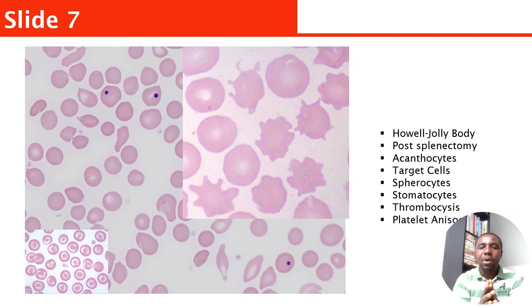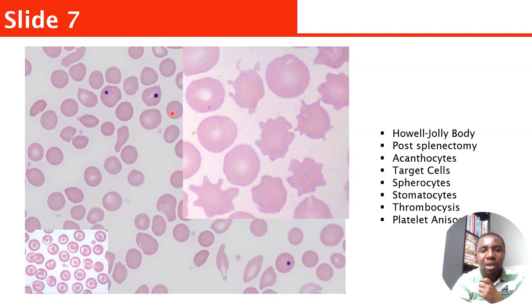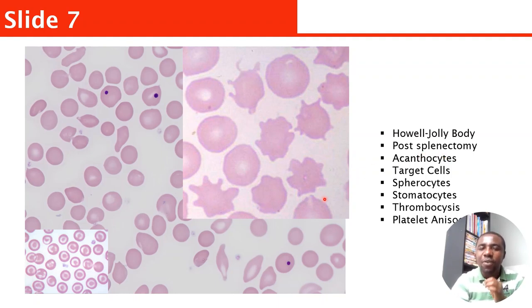This slide has target cells, acanthocytes, and Howell-Jolly bodies — that dot you see inside the red cell. Once you see Howell-Jolly bodies, acanthocytes, and target cells — sometimes even teardrops — start thinking about post-splenectomy. The giveaway features for post-splenectomy are acanthocytes, target cells, and Howell-Jolly bodies.